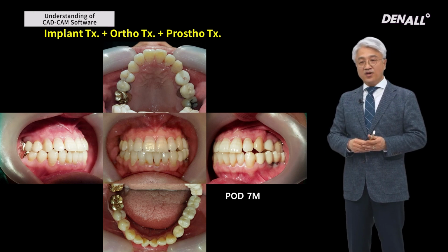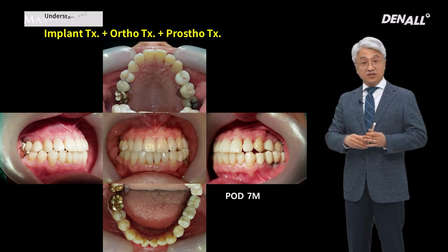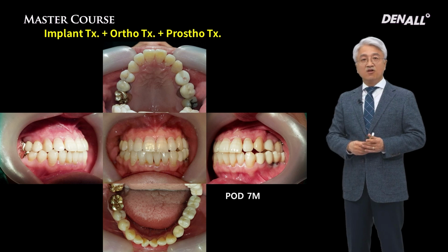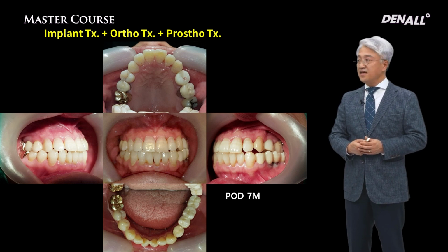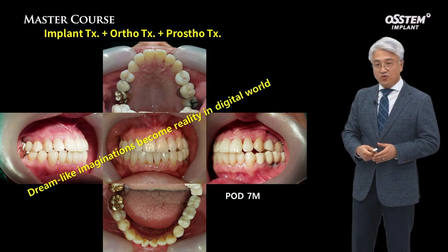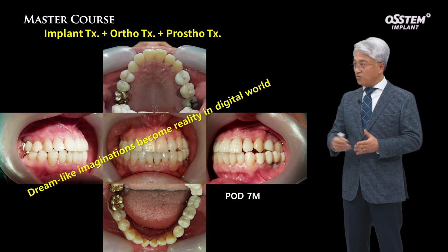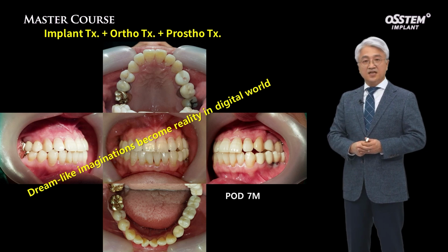3 different treatments have been provided to the patient at the same time, and they have been verified before they were performed. These treatment processes occurred simultaneously, and that's why the result was all the more satisfactory. What used to be only possible in imagination can now be done in reality, actually. And this is all thanks to digital dentistry.